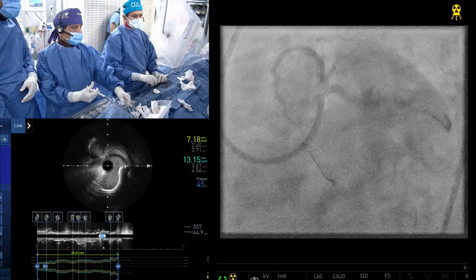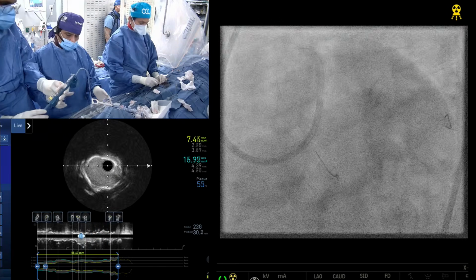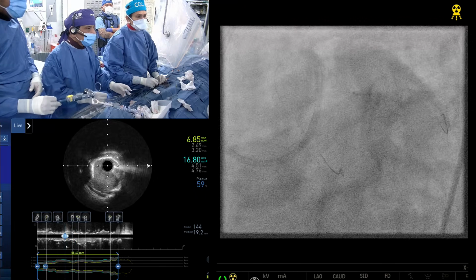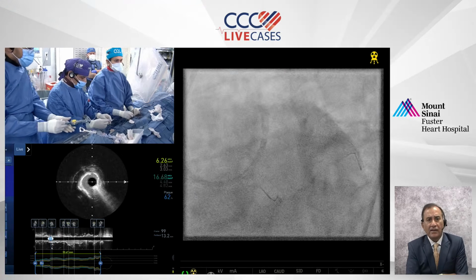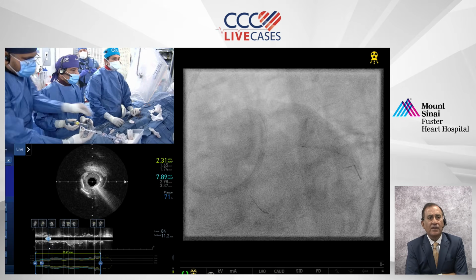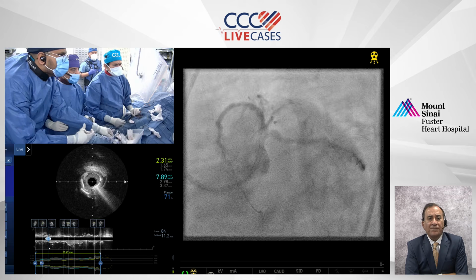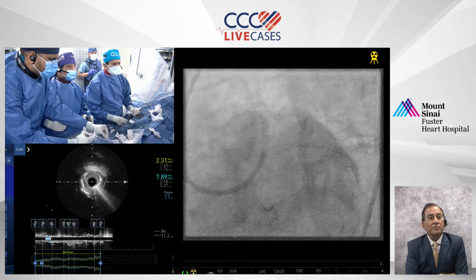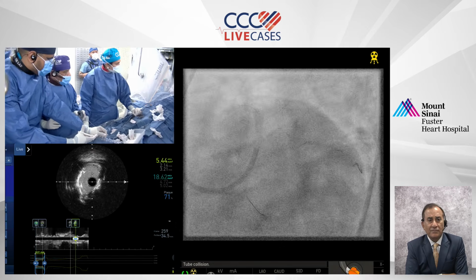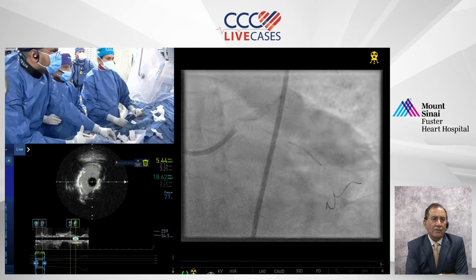Okay, now. Good. So, Samin, just looking at the early IVUS images, mainly relying on the angiographic, what kind of goal would you have in the left main area? Ideally the 865, the combo.